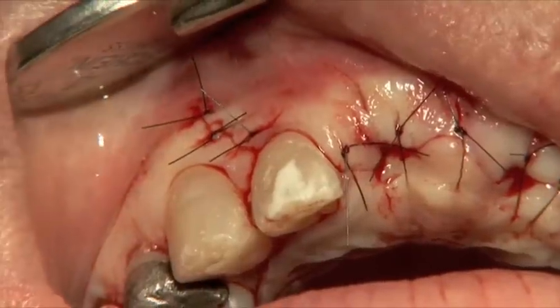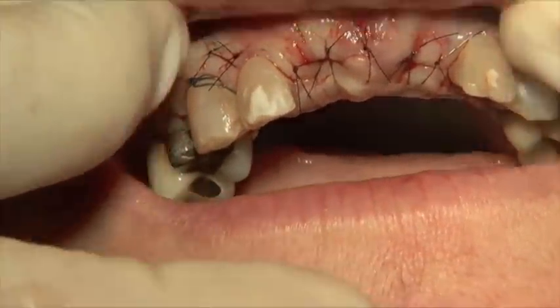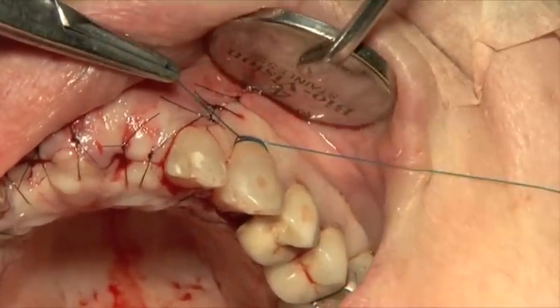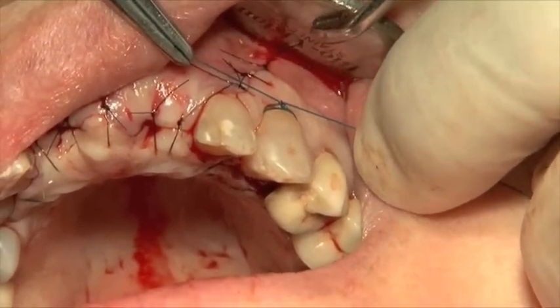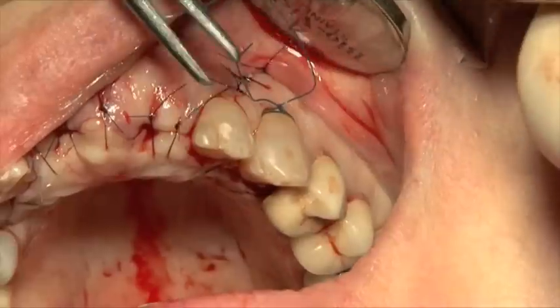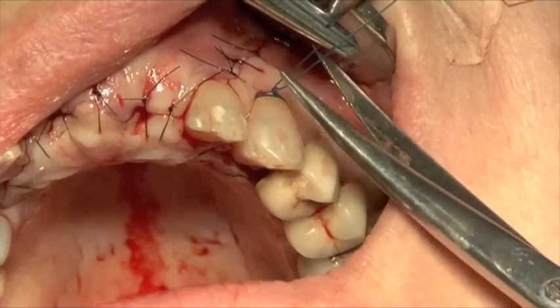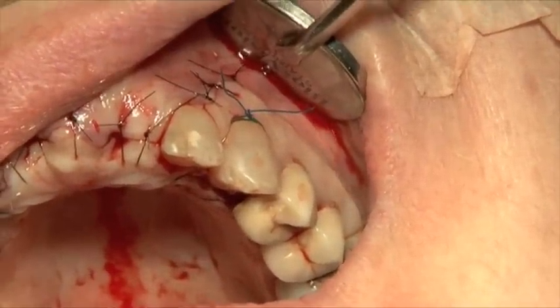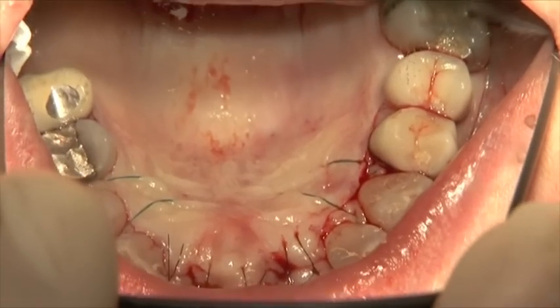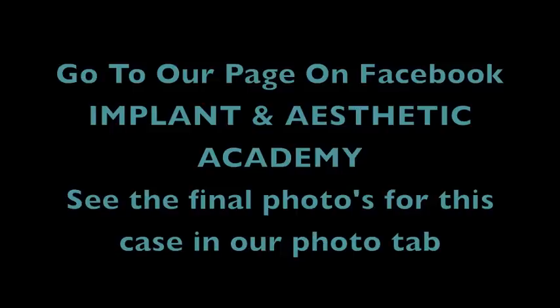Let's have a 4-0 now, please. See the edges now? The nicer position of the edges. Let's have a denture, please. Everyone happy?